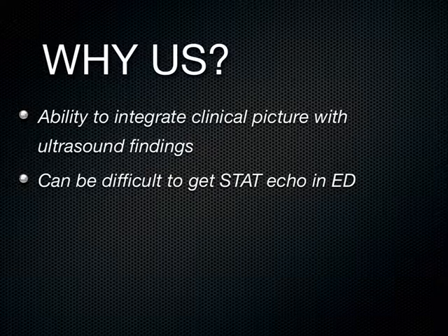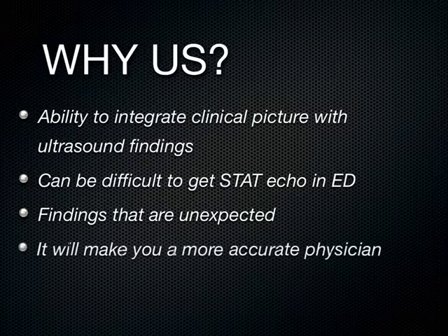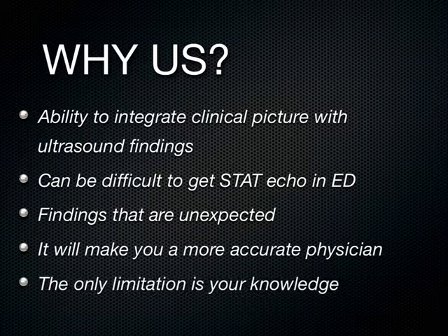We know sometimes it's difficult to get cardiology to come down and do a stat echo, depending on the time of day. And by stat, maybe it gets done in 15 minutes, maybe 20 minutes. I don't know. Stat for me means in the next 60 seconds. Also, in that patient, it was an unexpected finding. And I think all that makes you a more accurate physician, the only limitation being your knowledge.